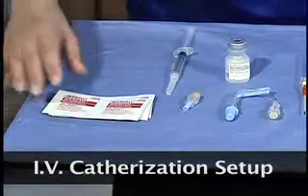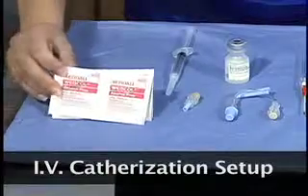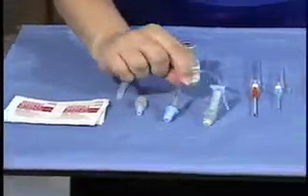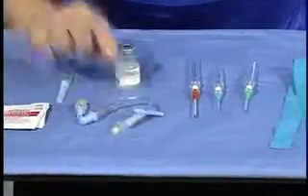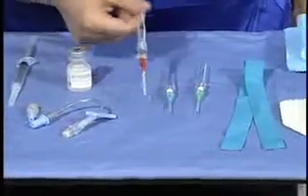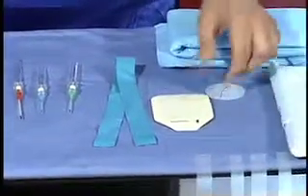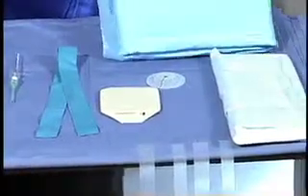The supplies needed to start an IV include antiseptic solution, an IV plug, extension tubing or IV fluid tubing, the IV catheter itself, a tourniquet, tape, a transparent dressing, and a drape or towel to protect the underlying surfaces.